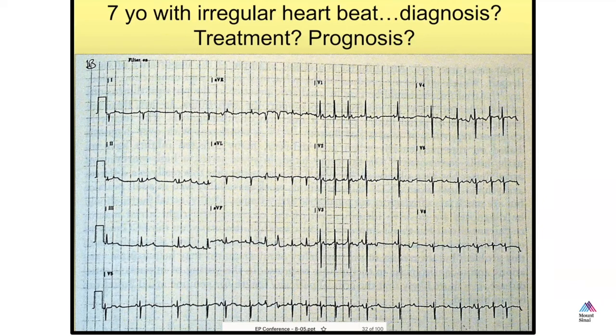Because in AFib, the atrium is going very rapidly and there's variable AV conduction. And so it is very typical in AFib that as opposed to, say, atrial flutter, where you have a constant atrial rate, and there's usually a consistent conduction, or at least in short periods of time, like let's say 2 to 1 or 3 to 2, and so the AV time is relatively regular. But in atrial fibrillation, you'll often have an irregularly irregular rhythm.